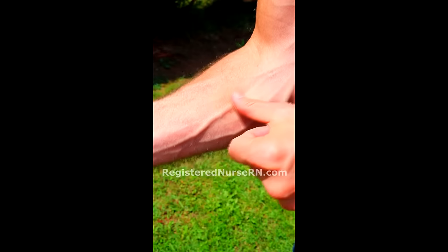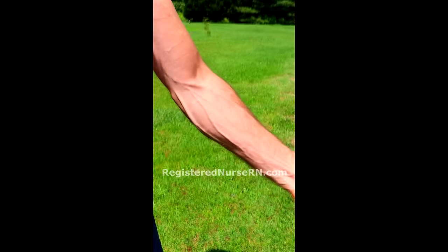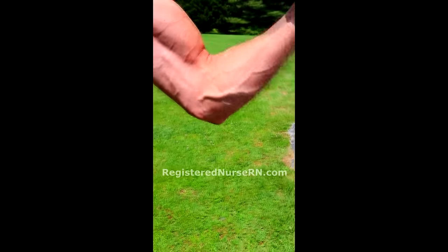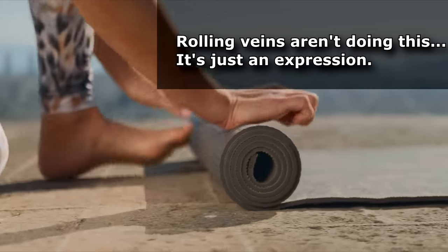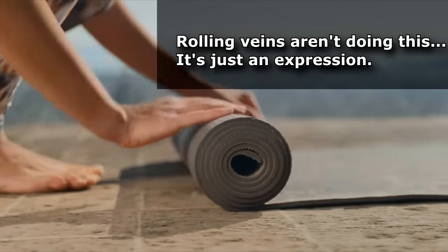Most patients won't have visible veins like this, but in my videos I like to use veins like this because it helps you visually understand what's going on under the skin. You may have heard the expression 'rolling veins' or hear another nurse say 'the vein rolled on me.' What that just means is that the vein moved — it doesn't necessarily mean the vein rolled on its axis. It's really just an expression we use to describe whenever this happens.